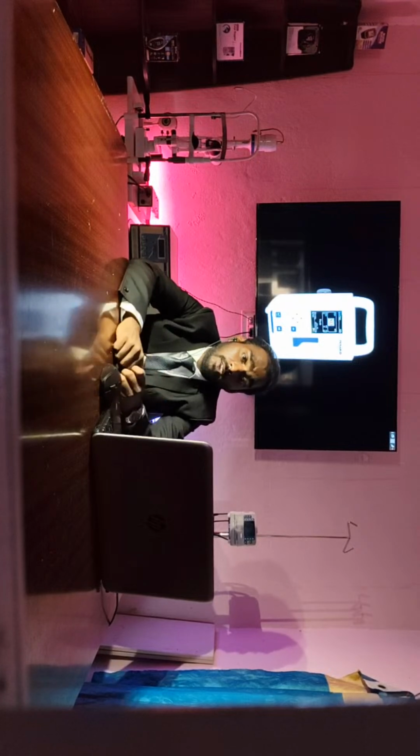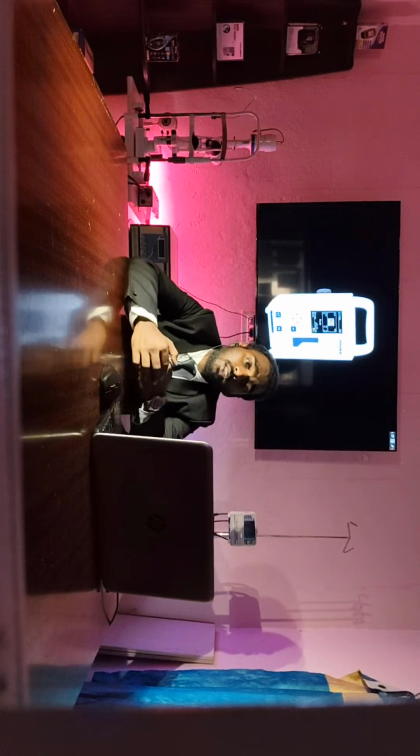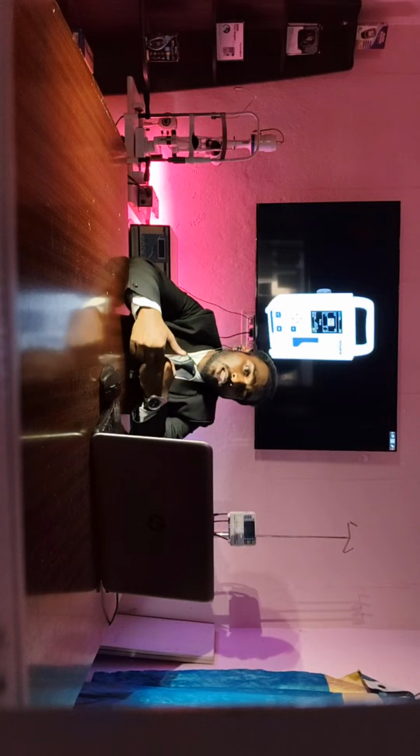You may have experience with this: some patients become dehydrated, and during that time they can't take proper food. At that time they take glucose or saline water in their body. What method do they use? They use the gravitational method. On the IV stand a glucose bottle is hanging, with IV lines, and an IV cannula is inserted into the patient. After connecting the tubing, the drug can be administered into the patient's body in a controlled manner.